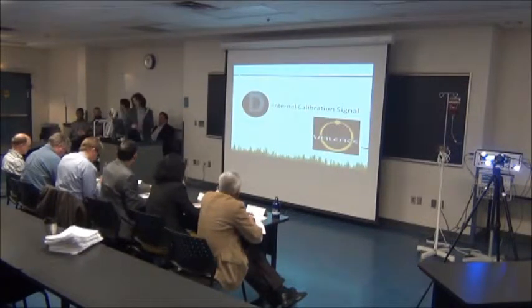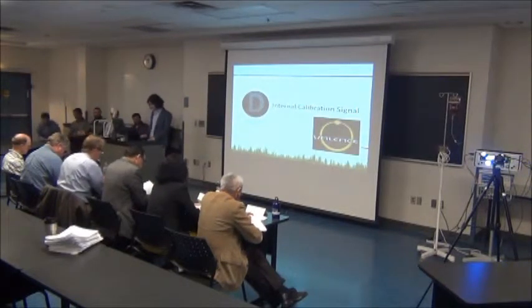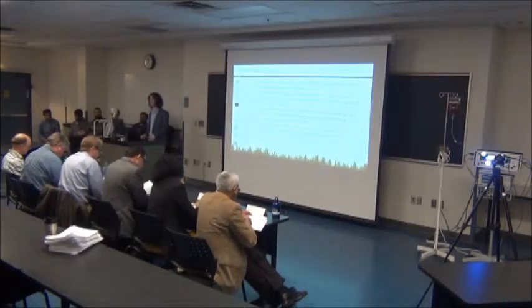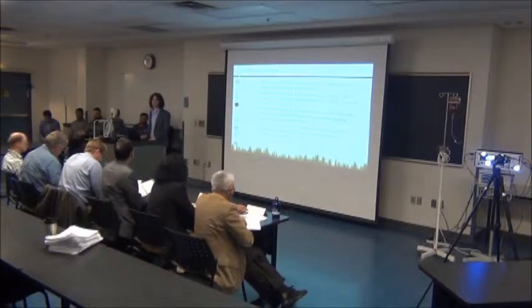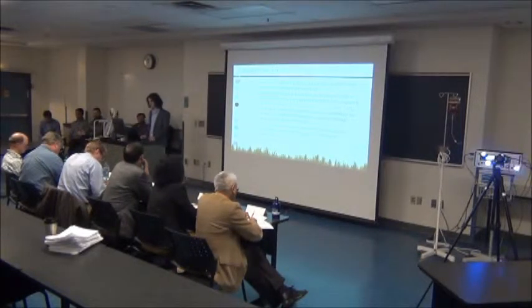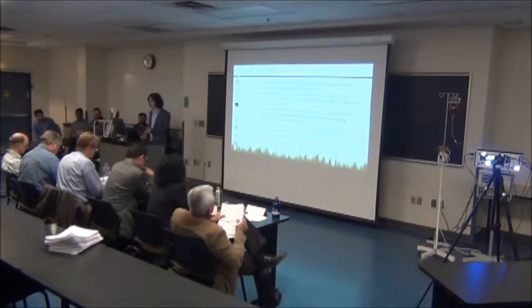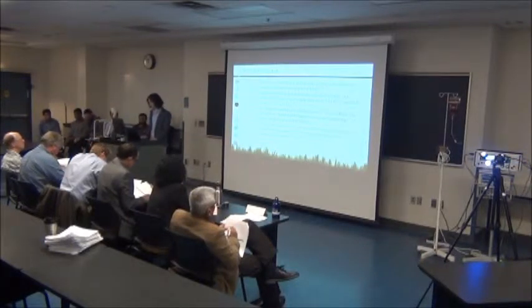Hello everyone. My name is Mo, and I'll be talking about the internal calibration circuit signal. To start off, what's the importance of the internal calibration signal? Basically, we inject some known values projected to the input of the instrumentation amplifier, and by reading the output of the signal at the display, we'll be able to compare the input, which is a known, static, and accurate signal, to the output of the instrumentation amplifier.